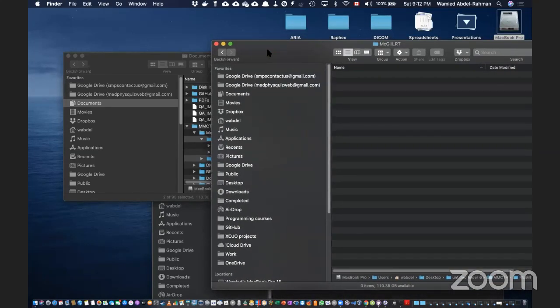So the work that we have been doing in beam modeling and so on is not useless, because I'm using the beam model that I tried to create in the past. I'm using it for MMCTP and so on.